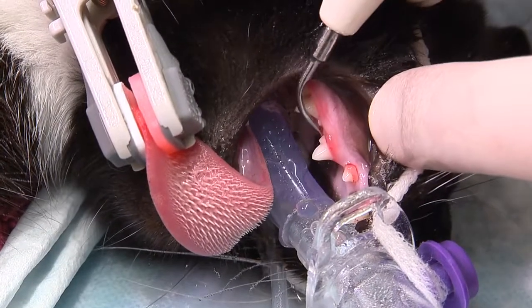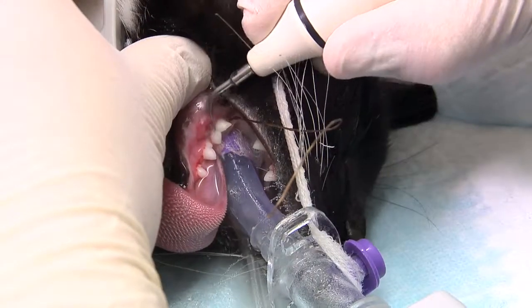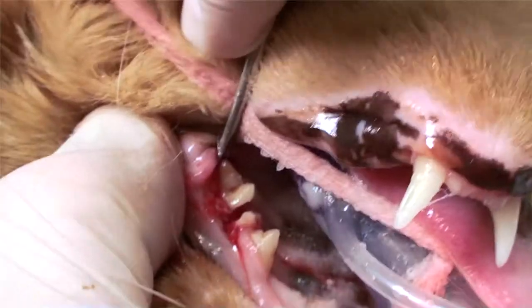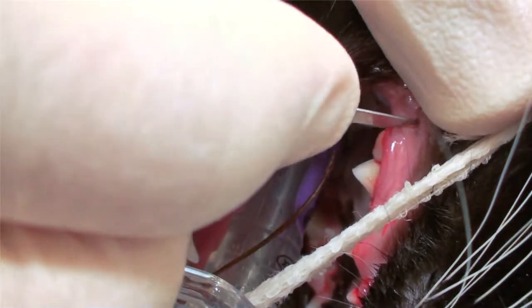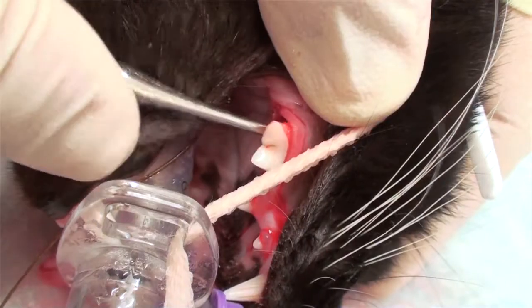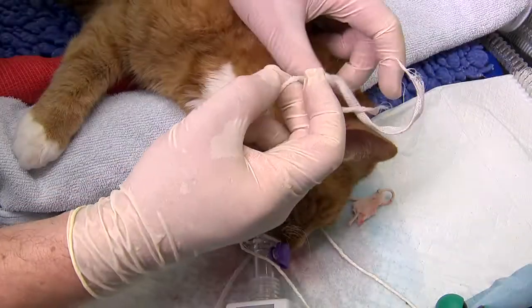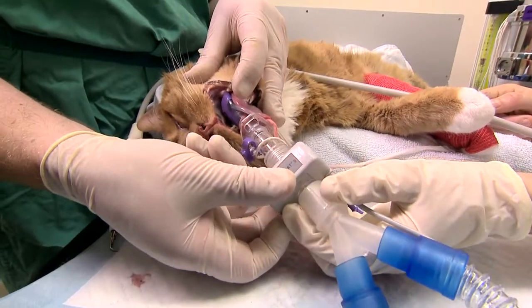As you can see, the V-gel does not get in the way of the dental instruments and allows good access to the back teeth. If you untie the V-tie and support the V-gel, it can be moved around widely, again improving access to the whole mouth.